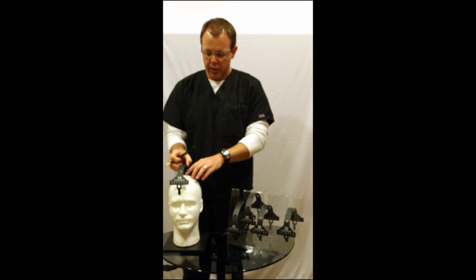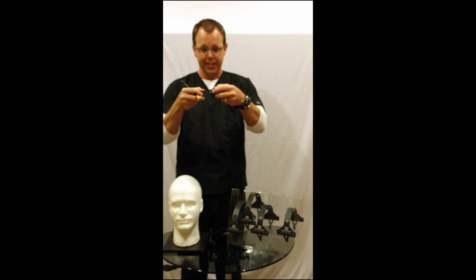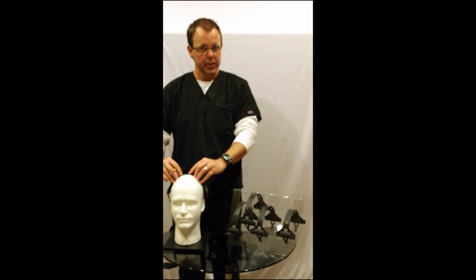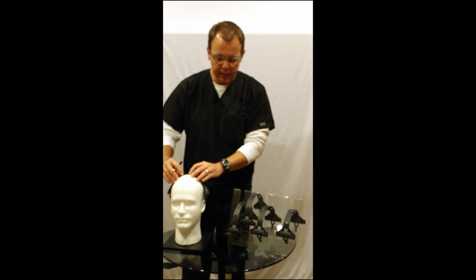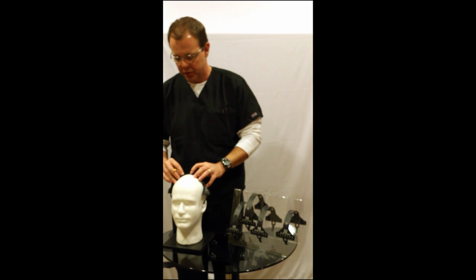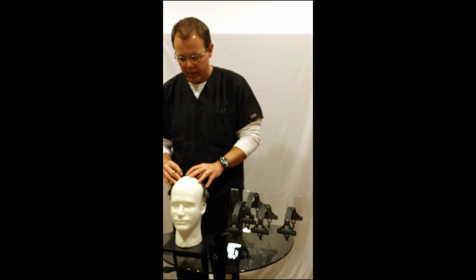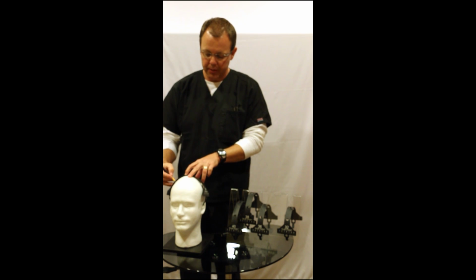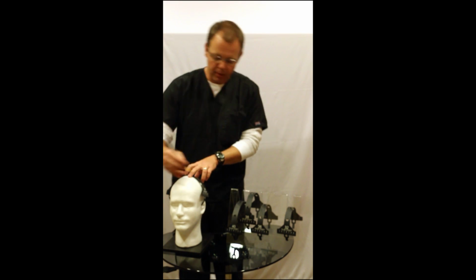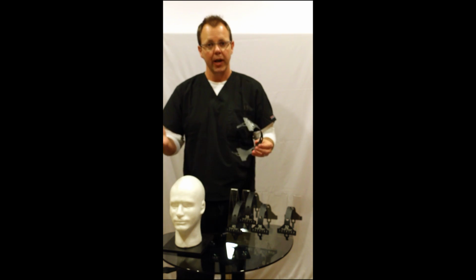Now, since the Y line was also 34 centimeters, I will take my CZ position, put it on top of and align it with the original CZ mark, and it should give me a balanced position to my other preauriculars. At that time, I mark 20%, 20%, and then my 10% mark, and my 10% mark. And now I'm done with my Y line.